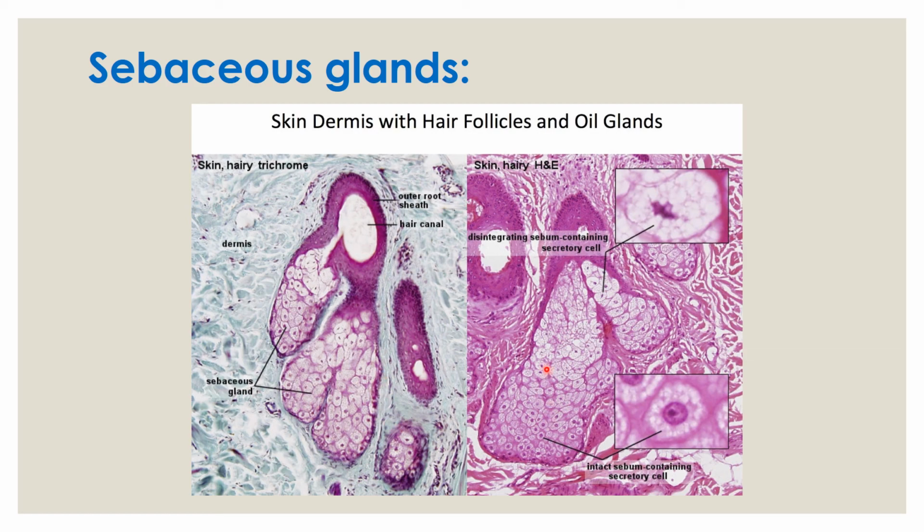And now you can see here this is the capsule which is surrounding these sebaceous glands, and there is the basal lamina and the basal layer of the sebaceous glands. Now this basal lamina or the germinativum layer proliferates and it pours the secretions towards the duct of the sebaceous gland, because the myoepithelial cells are absent here.